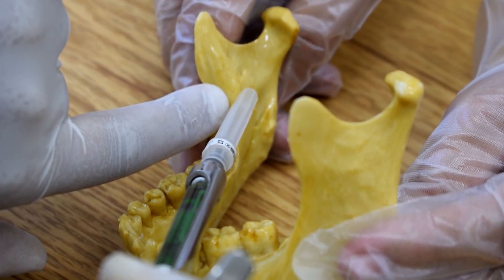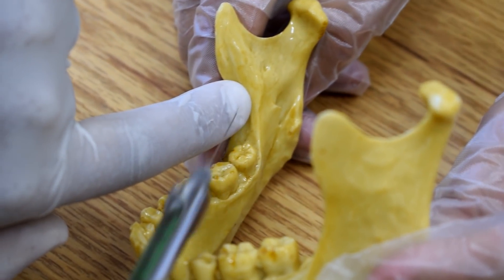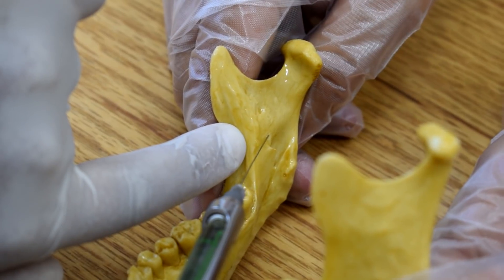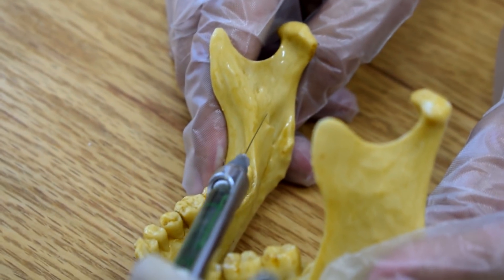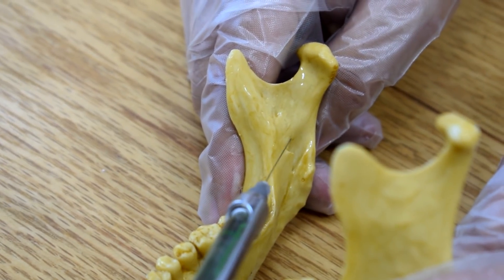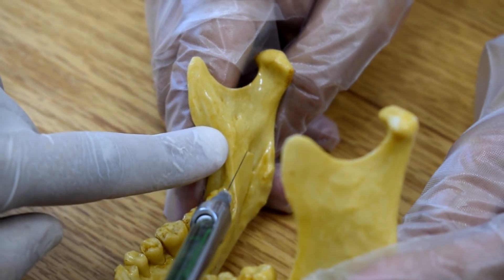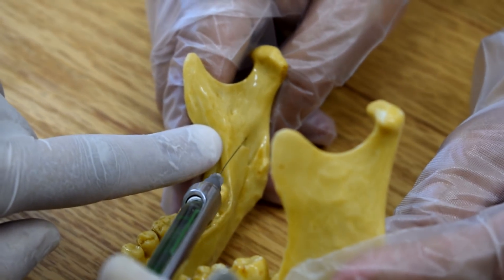Here, I have to advance my needle like this. This is where the needle should lie — just over the lingula, at the lingula here. The needle should lie here, like this, and should touch the bone here.